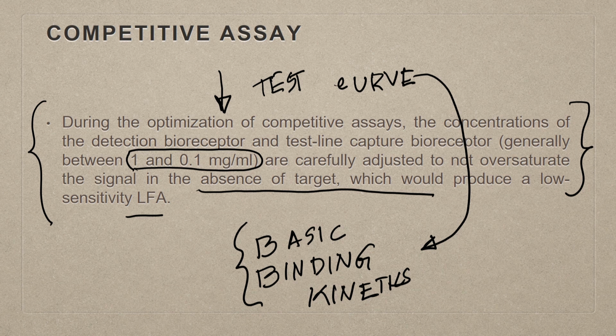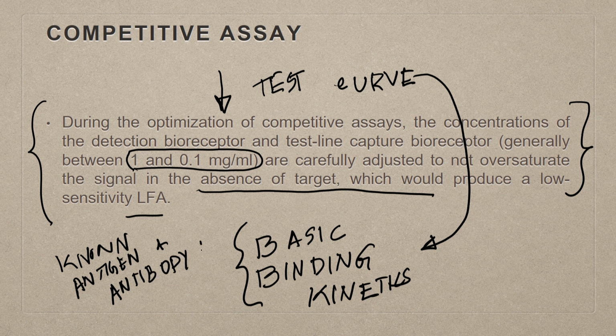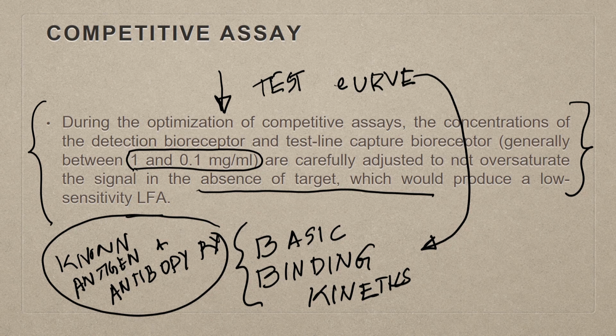So you should have an idea about the known antigen and antibody reaction. Without the known amount, it is tough to work with these kind of systems.